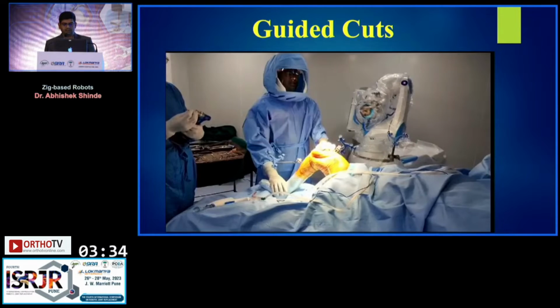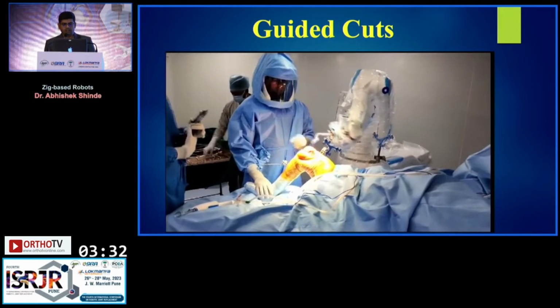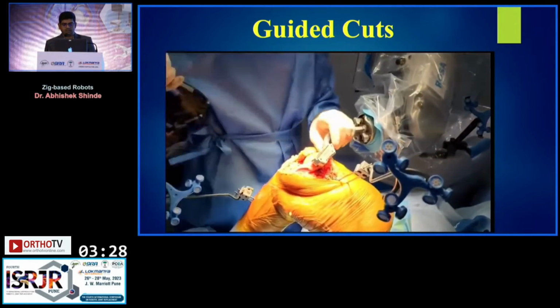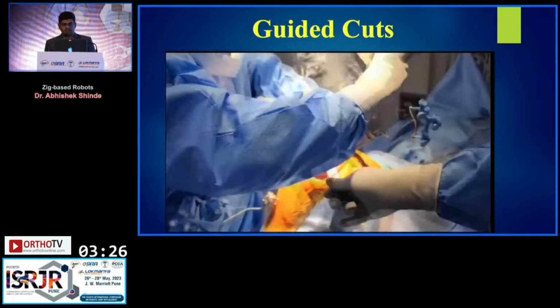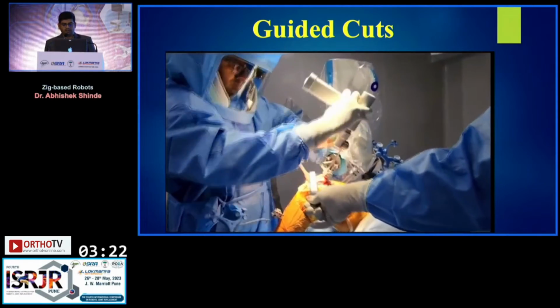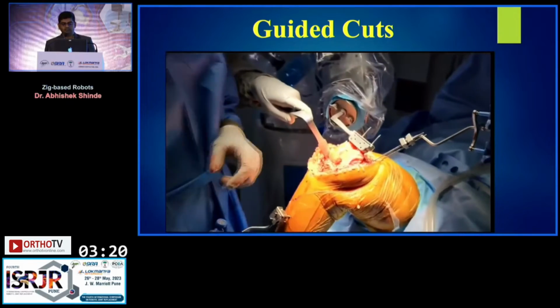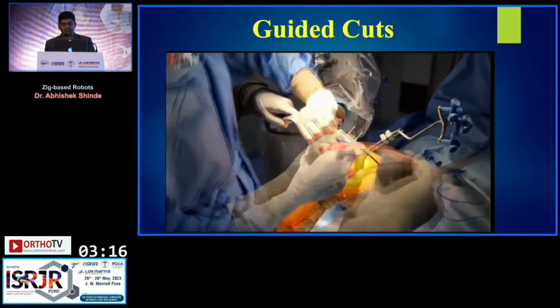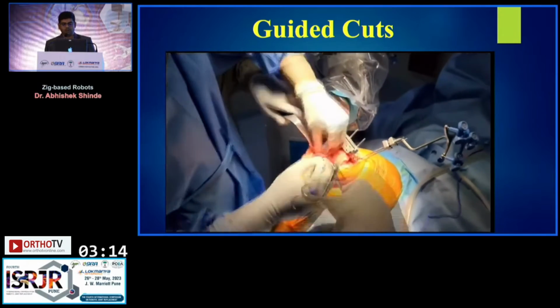Once the plan verification is done, the jig will automatically come and sit, and then you can recheck the live cut values, and once the cut is taken, you can check again whether the cut was taken properly or not.